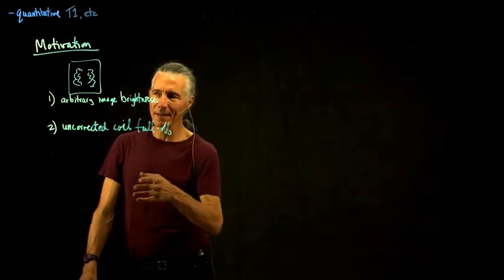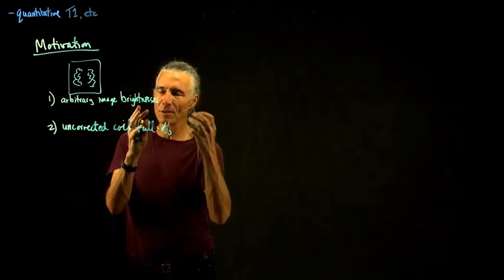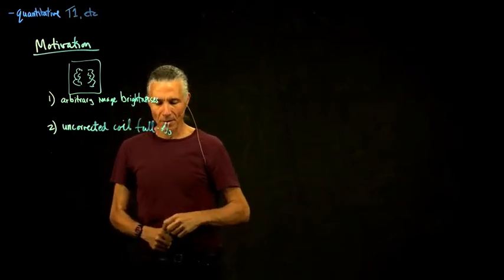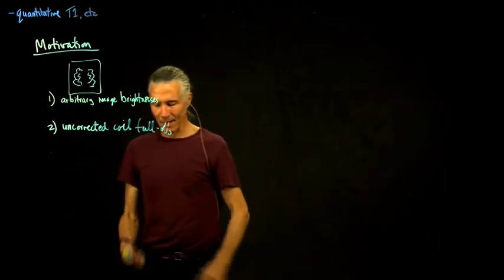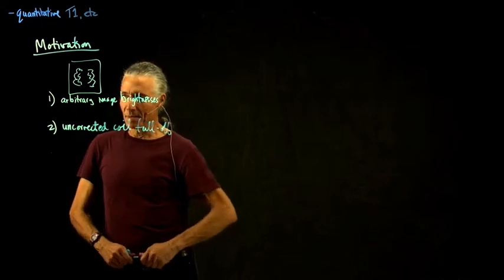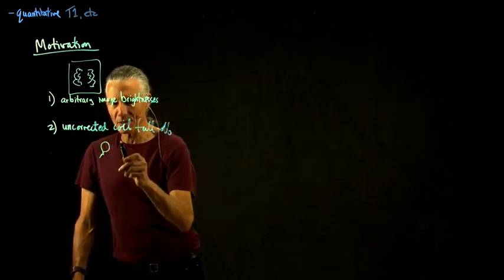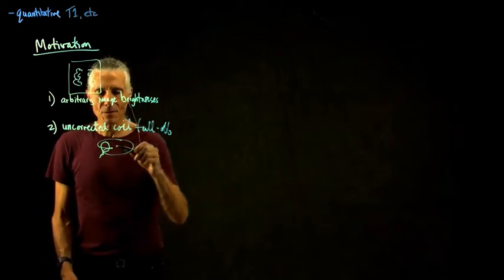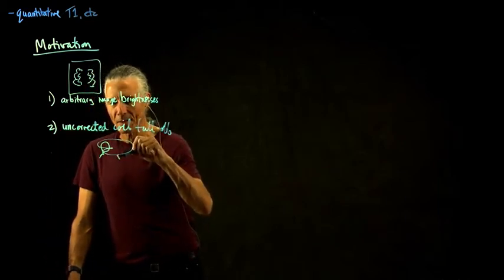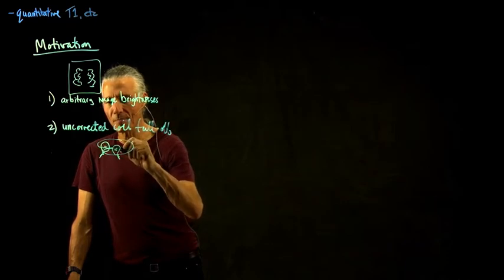But even in that case, there can be a problem. If you're off center in the head coil, you're closer to the head coil, there could be a bigger signal on that side. But in the modern world, we've got these small coils in there, and those small coils pick up much better from where the coil is over.